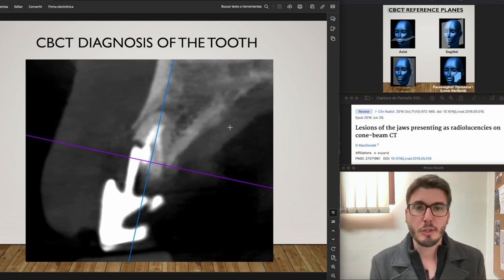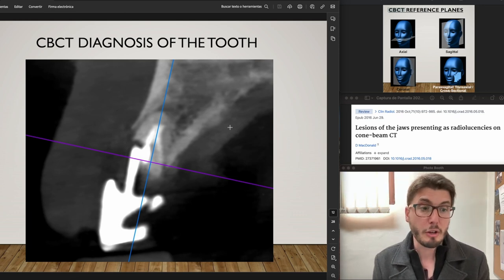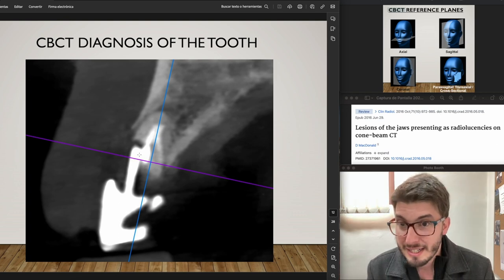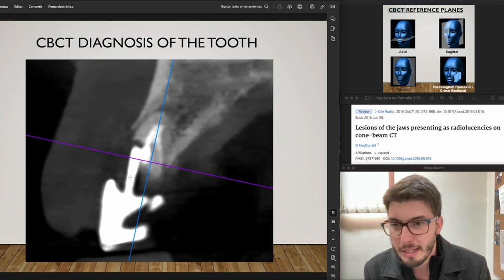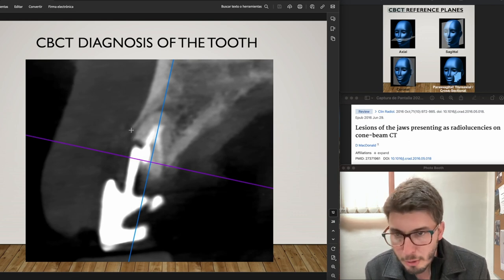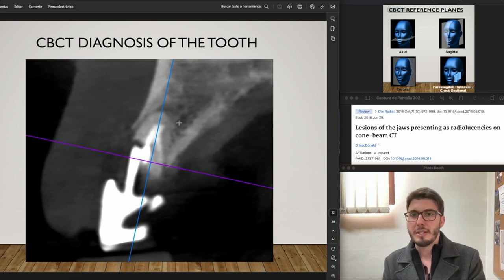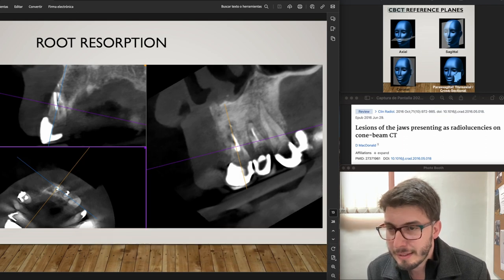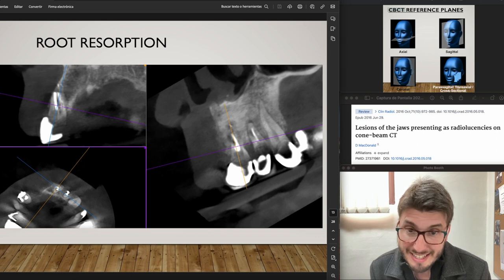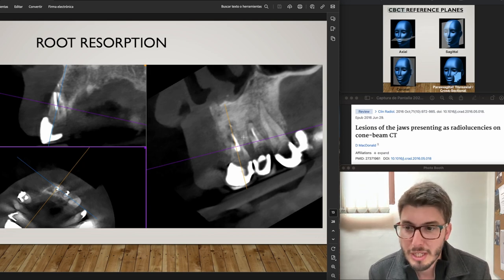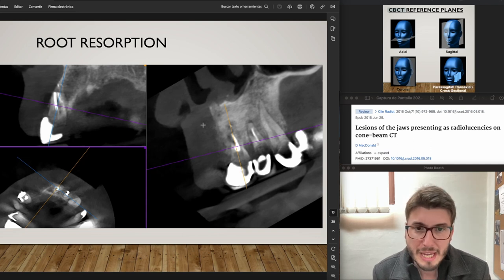If we need to diagnose every single tooth, we use cross-sectional images — sagittal transaxial or cross-sectional images. In this cross-sectional view, the post was too big and has resorbed the root. This is a completely failing restoration with buccal plate resorption and periapical alterations. Root resorption is present, and the metallic artifacts from root canal treatment may affect this assessment, but assessing in three different planes usually allows you to diagnose root resorption by seeing the shape of the root.